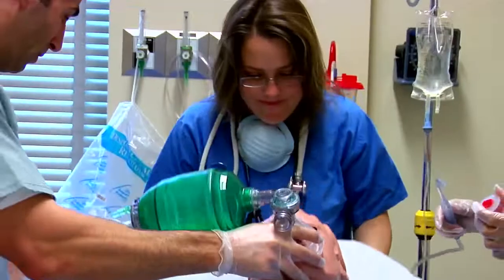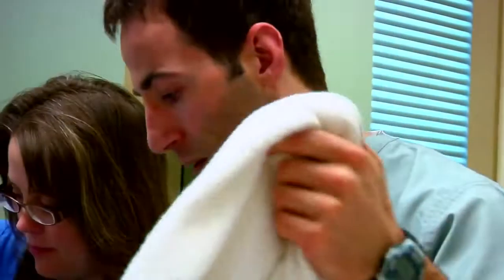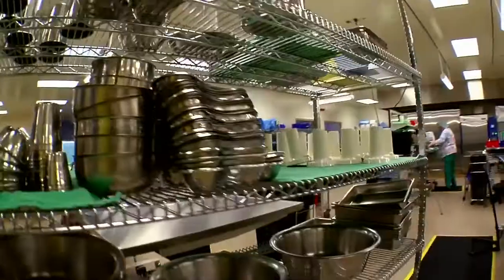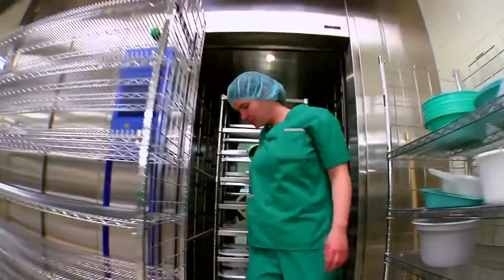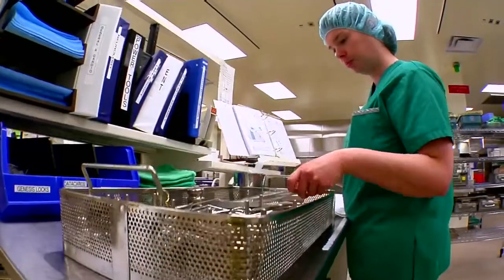Whether it's a routine ear exam or an emergency operation, doctors in the healthcare industry always need the finest tools for the job. Before they make it into the doctor's hands though, surgical instruments have a whole other life behind the scenes. Enter the medical device reprocessing technician — it's the technician's duty to clean and prepare the equipment used throughout the healthcare industry.